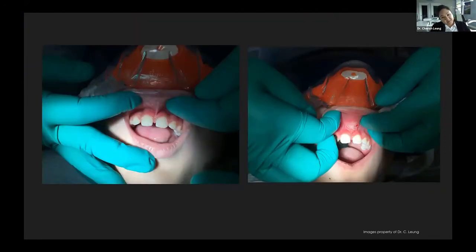This is one of the lip ties we release. So he has a giant diastema, and then also was having a lot of issues with the food trapping up there, which he didn't like personally. Older kid again. And so we did a release, and I didn't pull the lip all the way up, but you can see a nice little diamond there without bleeding. This is immediately after.